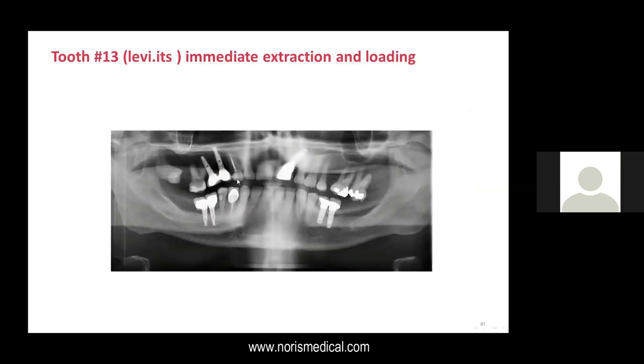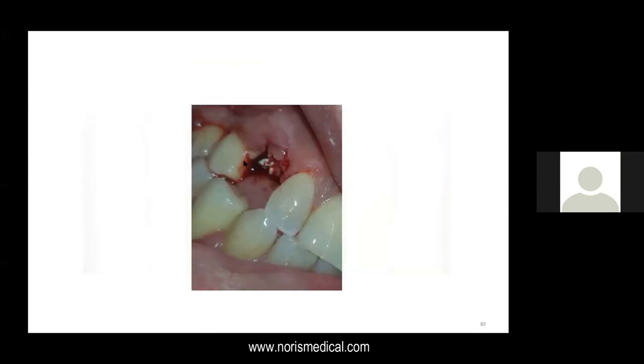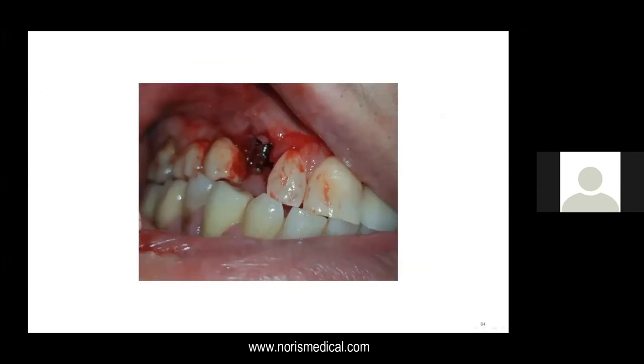Here you can see tooth number 13. You can see the caries there. Usually the patients come when the tooth actually breaks. So this is the situation when the patient comes, and he wants a solution, of course, on the same day. He doesn't want to wait even an hour or two. So extracting the tooth and doing the implant is very easy.